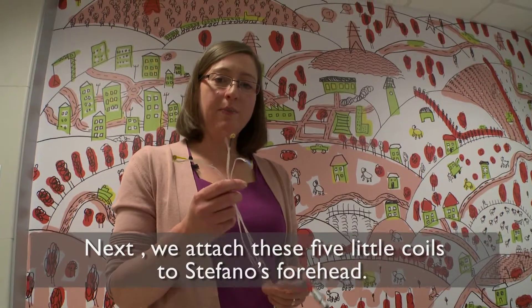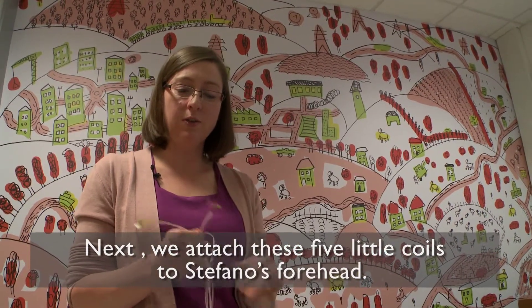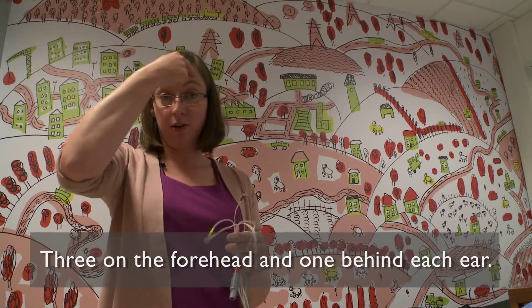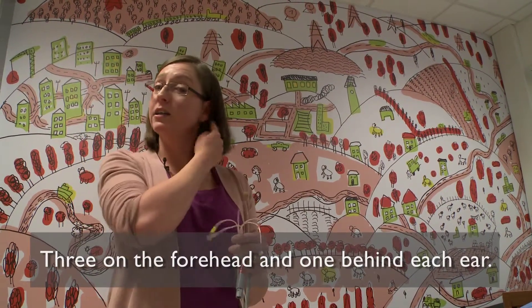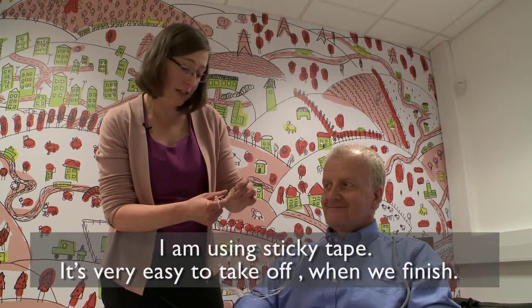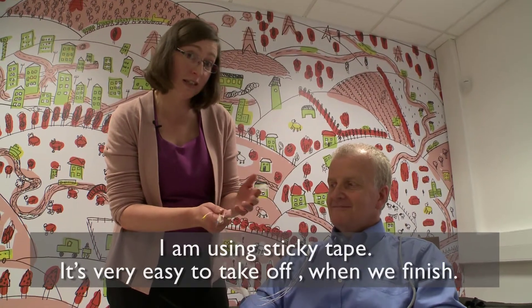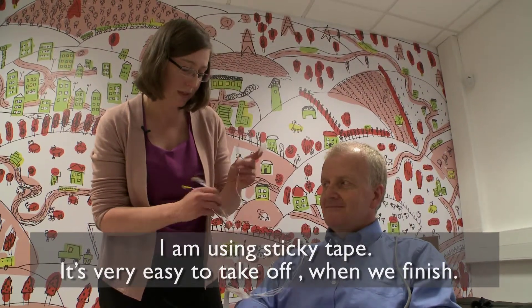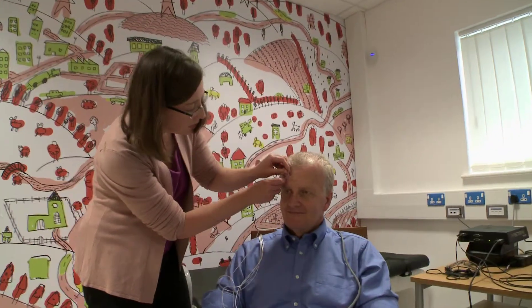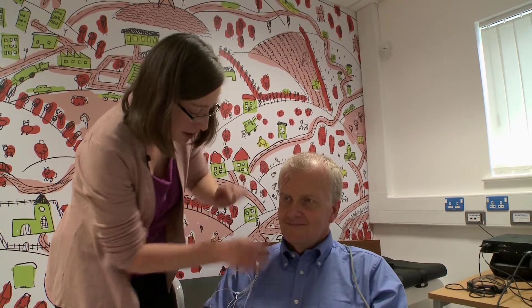The next step is for us to attach these five little coils to Stefano's forehead. They're very small and we just attach them with tape. Three of them go across the top of his forehead and one behind each ear. I'm going to stick this on just with sticky tape like that, so it's very easy to take off after we're finished.